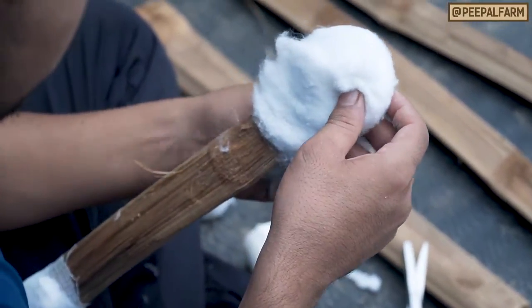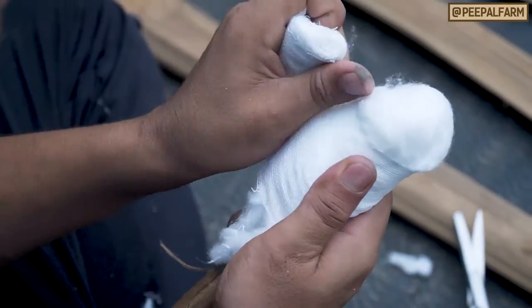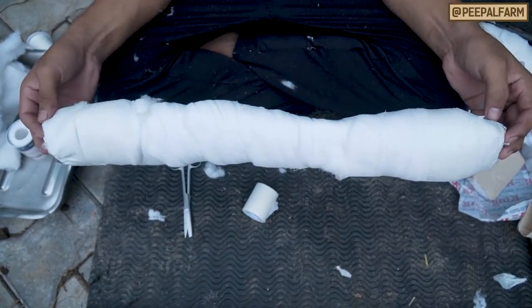Step 2: Cushion the splint. Use gauze and cotton wrapped around the splints to make them soft and cushioned. Hard, uncushioned pieces can rub against the skin, making any injuries worse.